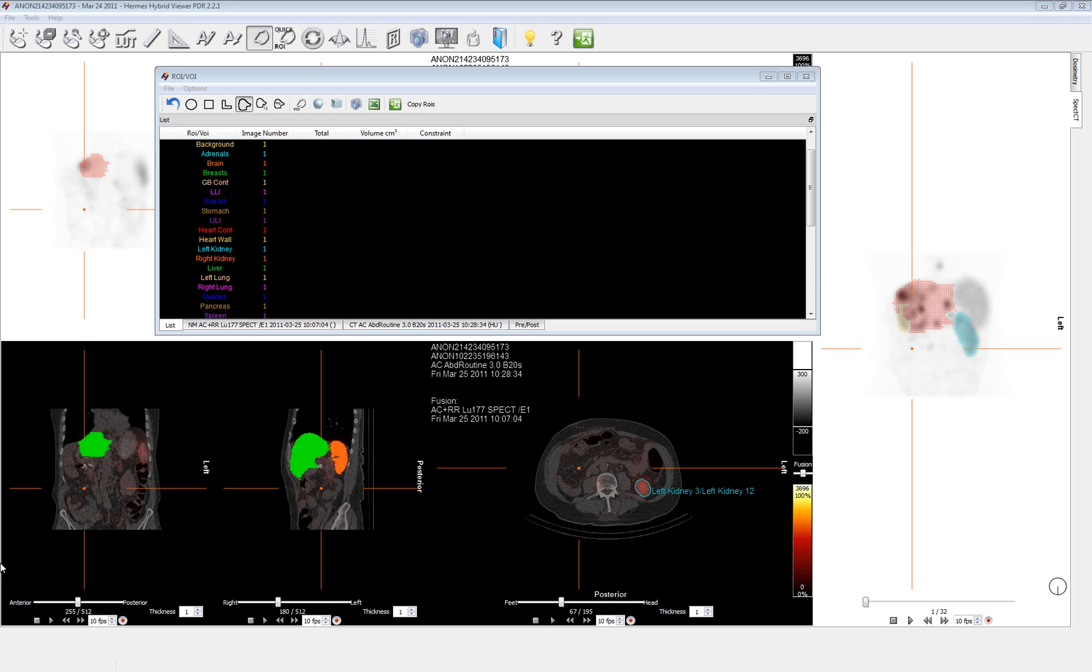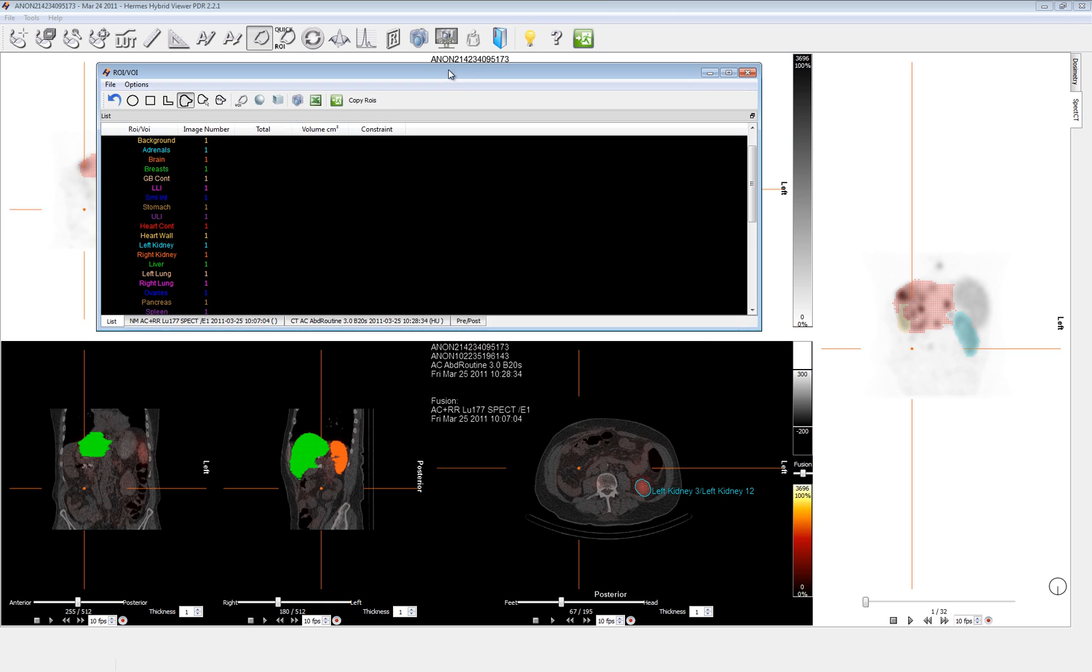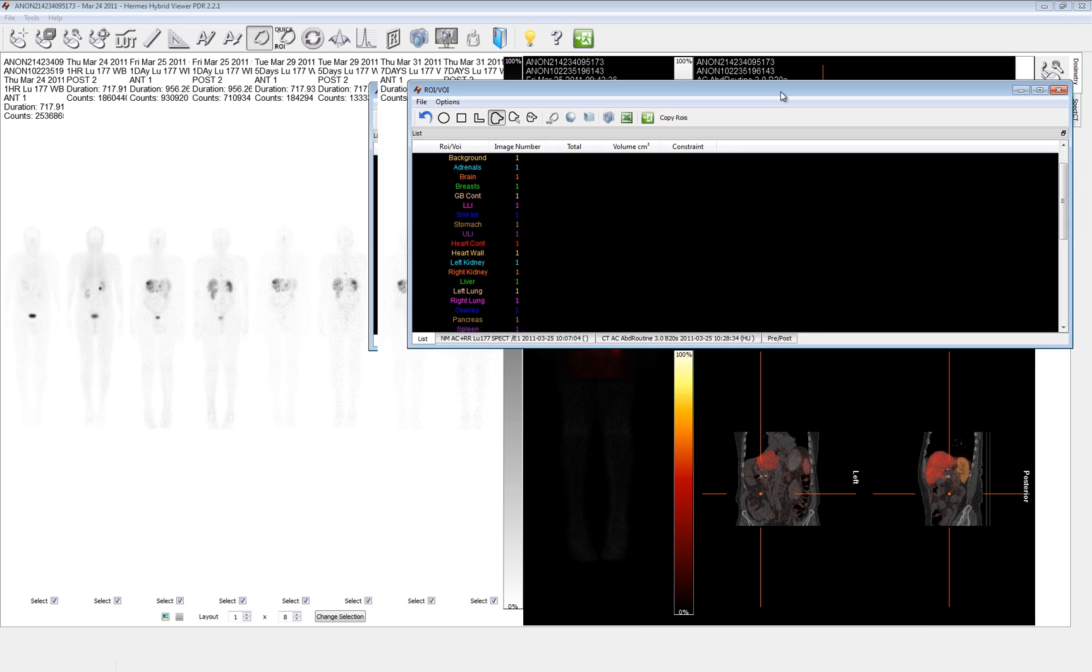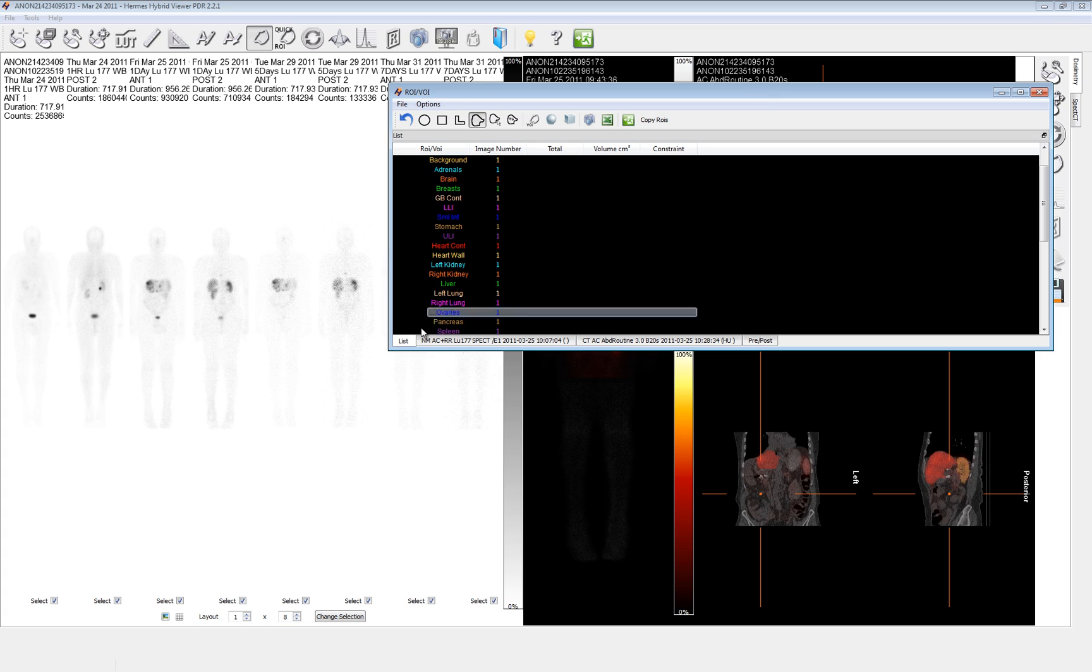So now we've skipped ahead a little bit and we're showing the volumes of interest as they're drawn. There's the liver and one of the kidneys and the other kidney also visible in the MIP. Those are the only three organs which we've really defined and that comes from the fact that they are the only three organs which are truly visible in the whole body image. The way the calculations are started is that we begin with for each image a total amount of activity in the whole image and then for each organ that we specify we subtract the amount that's in the area specified.